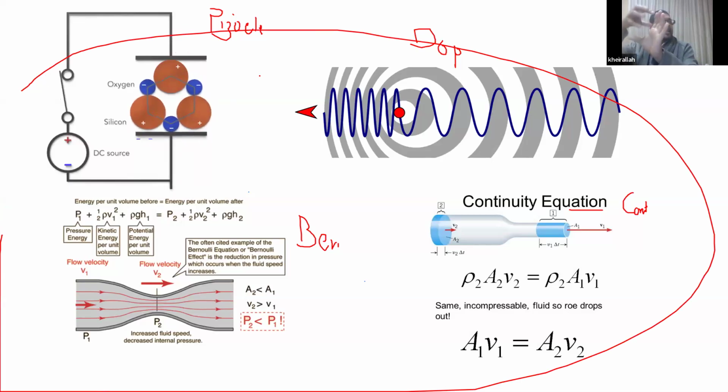which is basically how electric current changes the crystal to oscillate and produce ultrasound wave, and how the returning echoes transform or deform the crystals to generate electricity. So the piezoelectric effect goes bidirectional. Electricity into ultrasound and ultrasound into electrical effect. So it goes this way, yeah? So this is how we generate ultrasound and how we generate the image.